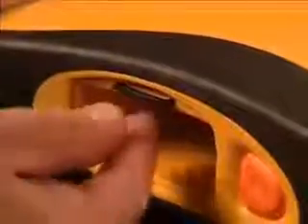To remove the data card, push the card in until you feel it click. The card will be partially ejected out of the slot and may then be removed.